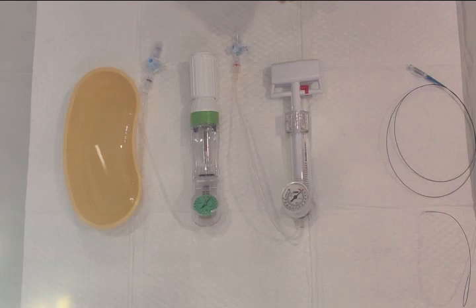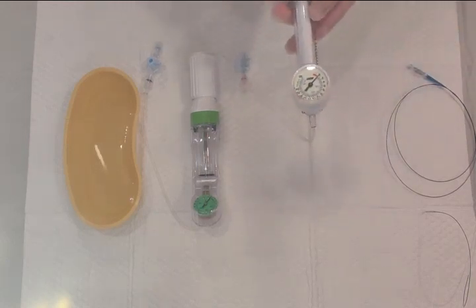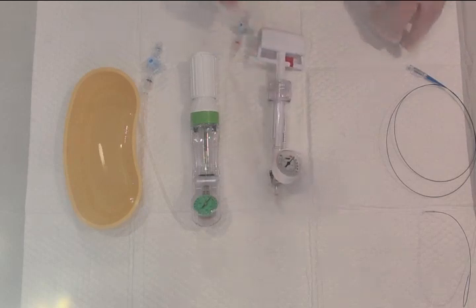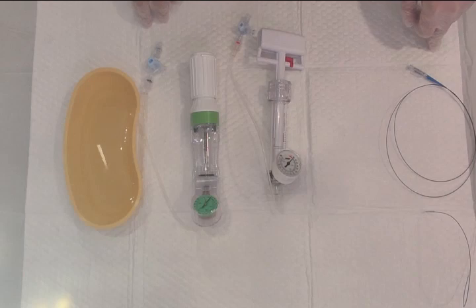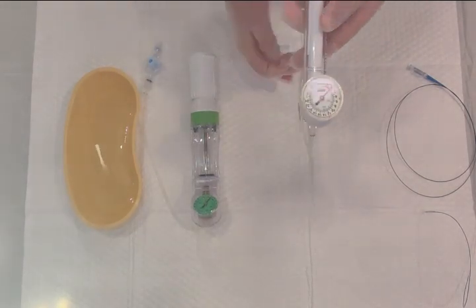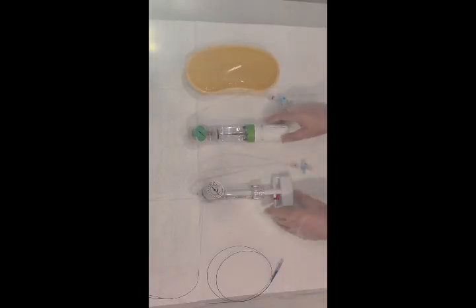An inflation device is a device used to inflate coronary or vascular balloons, or to deploy inflatable stents — not self-expandable stents. This is how the inflation device looks like. As you can see, there are different sorts of inflation devices.